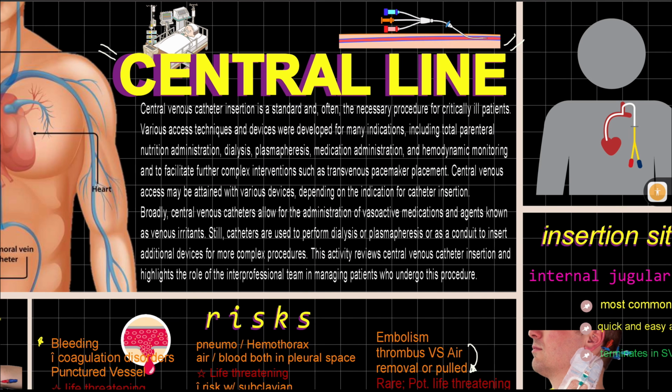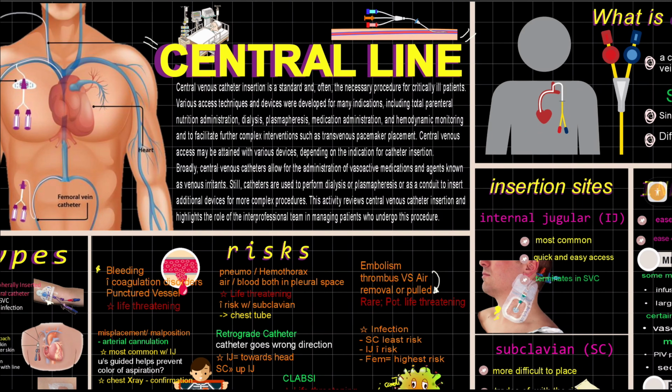Central venous catheter insertion is a standard and often necessary procedure for critically ill patients. Various access techniques and devices were developed for many indications, including total parenteral nutrition administration, dialysis, plasmapheresis, medication administration, and hemodynamic monitoring to facilitate further complex interventions such as transvenous pacemaker placement. Central venous access may be attained by various devices depending on the indication for catheter insertion.